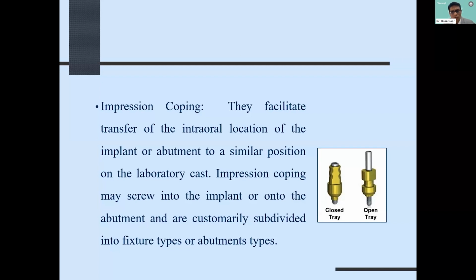Impression copings are of two types. They can either be screwed into the implant or they have a snap fit kind of ones also. Then we have the closed tray or the open tray.